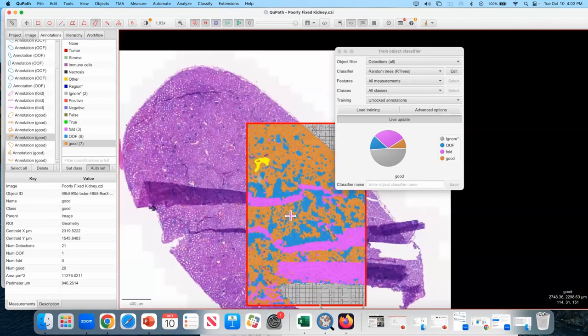So the overall impression you get is, where is it bubbly? Where is it folded over? And where is it actually good? And then you can count how many superpixels are each and decide this tissue is 80% good quality, compare different fixative types, fixation profiles, and figure out which one is quantitatively the best. Tying this back into the cell detection, you can also convert these into annotations with one of the other options in that tool, and then run the cell detection just within the good areas.